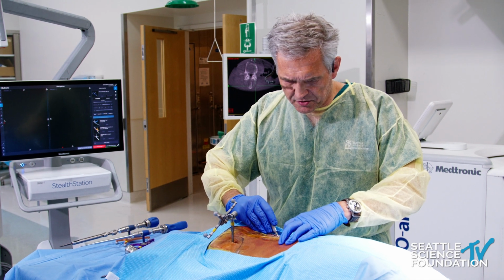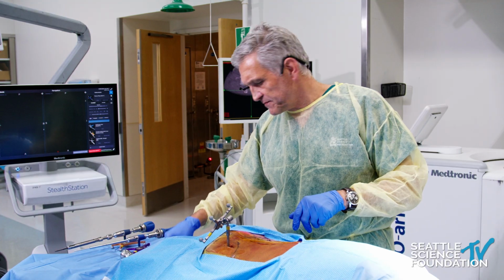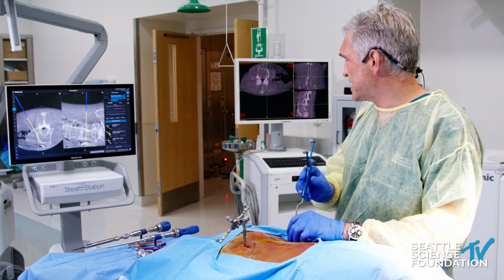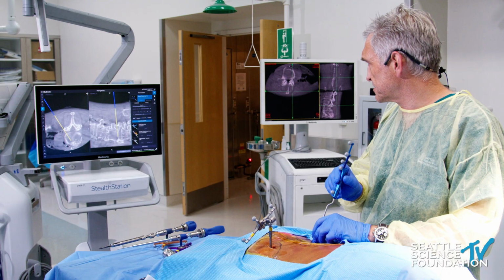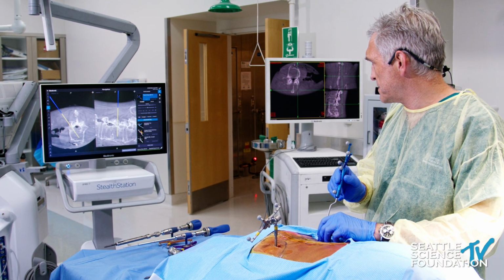So then I continue down either with blunt dissection or sharp dissection down to the fascia. So the fascial plane, then you can see here the muscle, the fascia. You can see that actually the navigation is really nice and accurate. I'm right on the muscle fascia.